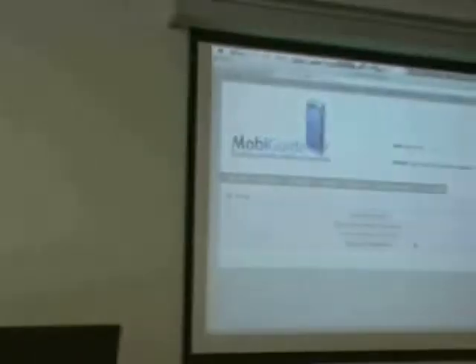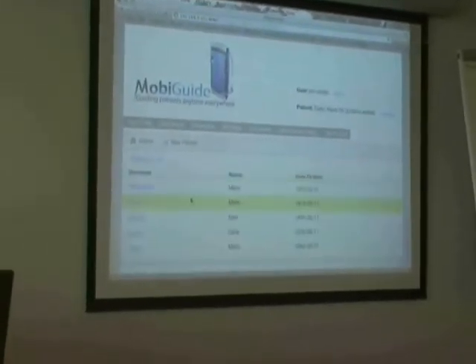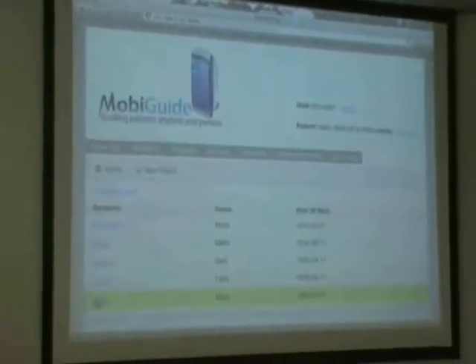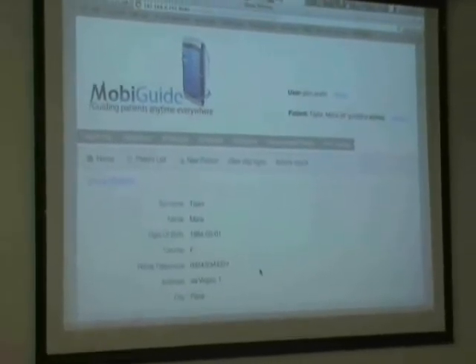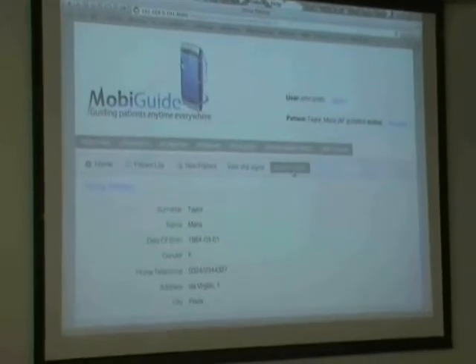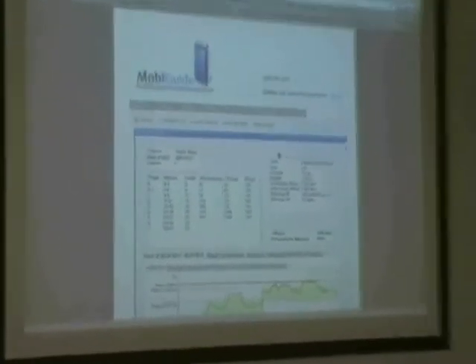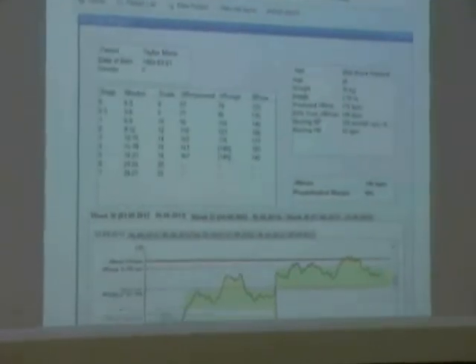So the University of Twente, and in particular Nekane, made a mock-up of the correlation between activity intensity, heart rate, AI and AF. So maybe you can tell something about it. So you saw a button. It could be coupled like this to the caregiver interface. Well, first I think we need to clap.